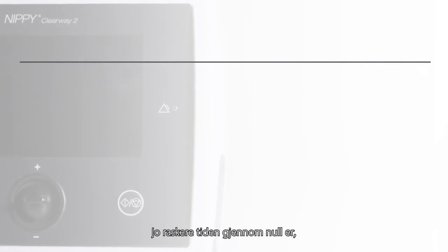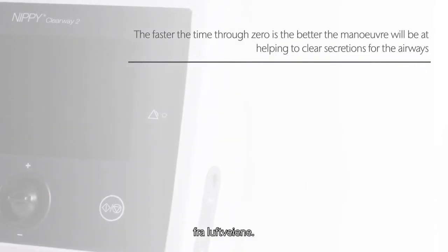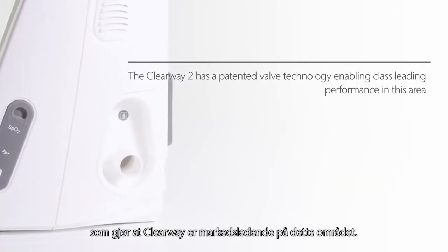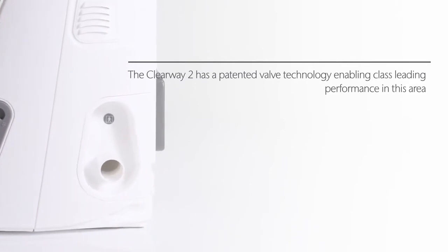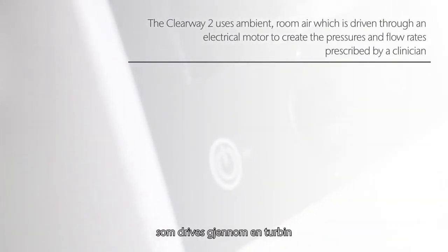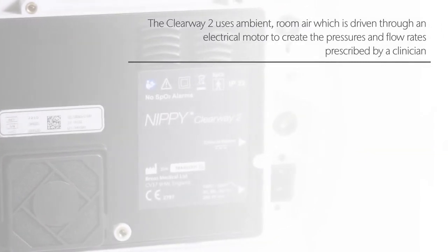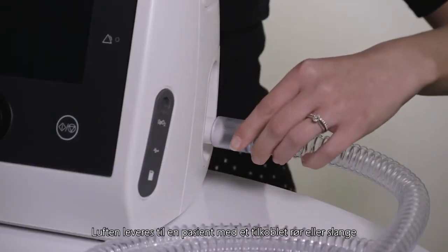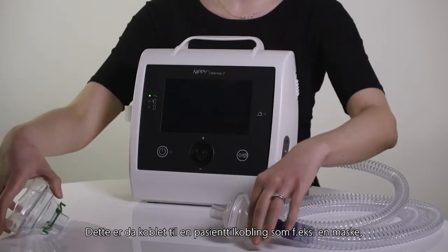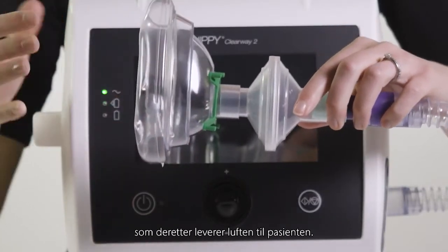The faster the time through zero is, the better the manoeuvre will be at helping to clear secretions from the airways. The Clearway 2 has a patented valve technology enabling class leading performance in this area. The Clearway 2 uses ambient room air which is driven through an electrical motor to create the pressures and flow rates prescribed by a clinician. The air is delivered to a patient by a connecting tube or hose known as a circuit, which is then connected to an interface such as a mask to deliver the air to the patient.